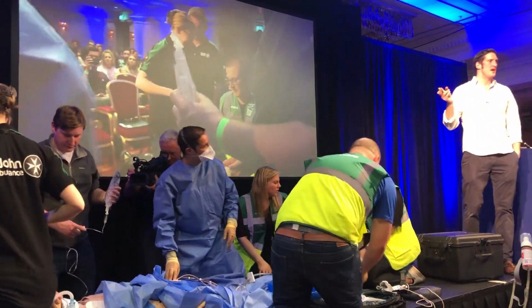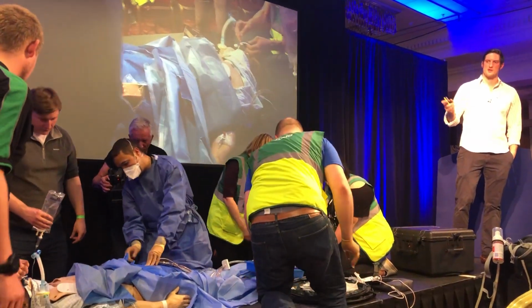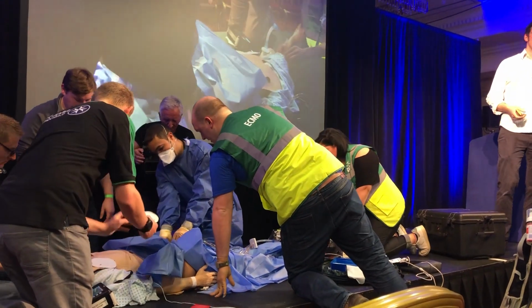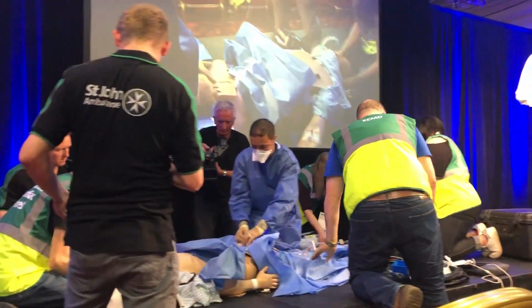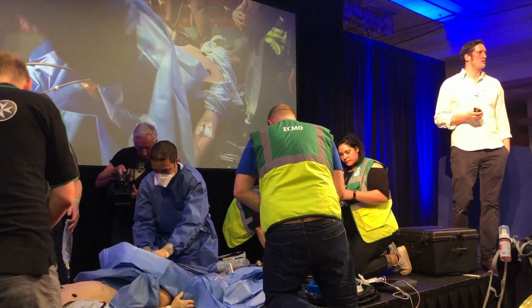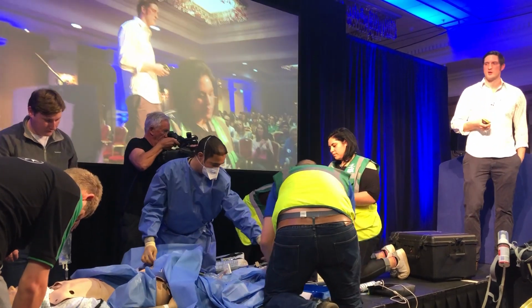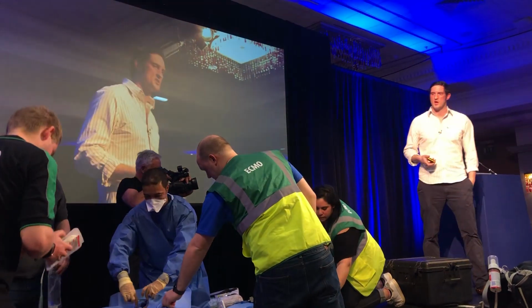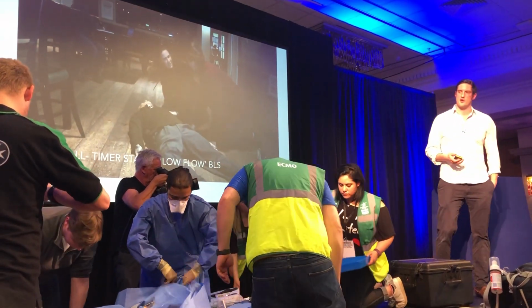From the time that the ECMO guys were there to going onto full flow was 15 minutes. Of course it's not a real person, and of course there are things that slow you down in real life, but we do ECPR and it's not that much longer. We wouldn't do it if we thought it was going to take 60 minutes; then we would wait at the hospital. But we think we can achieve it much quicker, and we think that might give us a chance of improving survival. By no means guaranteed.